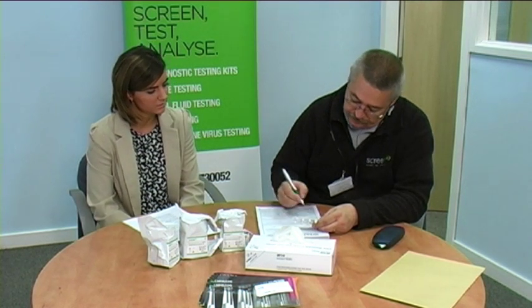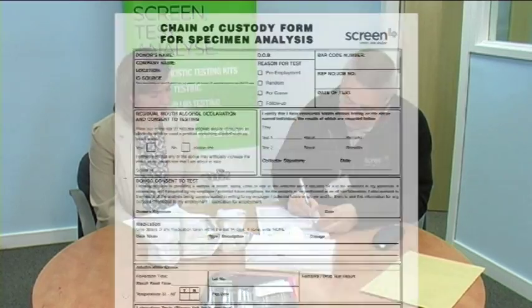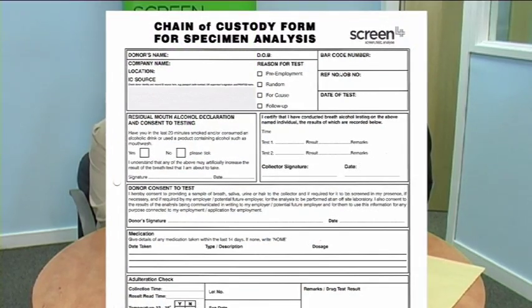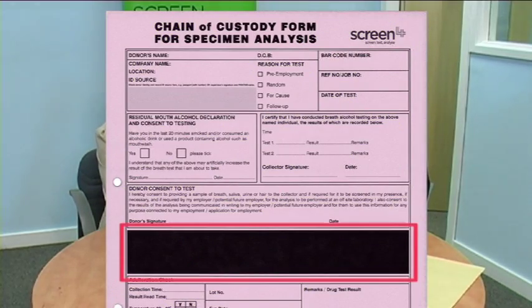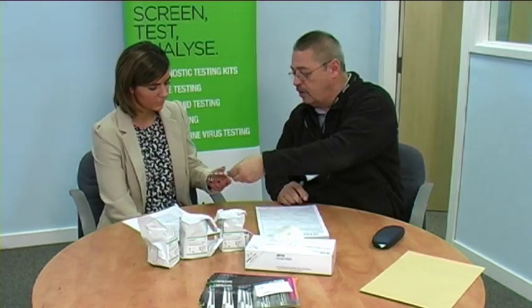Are you taking any medication? Firstly, the donor will be asked to disclose any medication she or he may have taken in the last 14 days, either prescription or otherwise. Certain medicines and over-the-counter remedies contain substances that can affect the result of the test. It's vital that this information is provided accurately. This is recorded on the multi-part form, but not divulged to your employer.